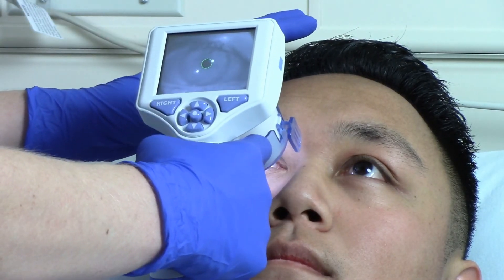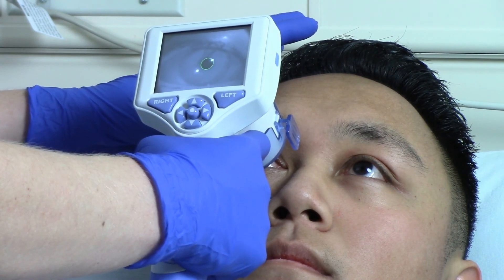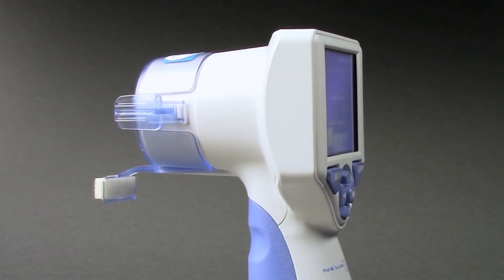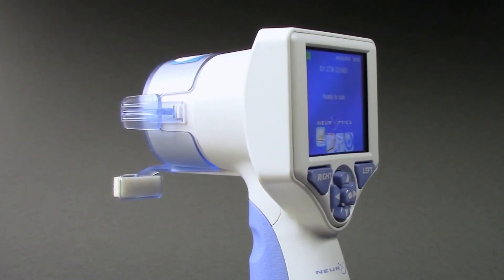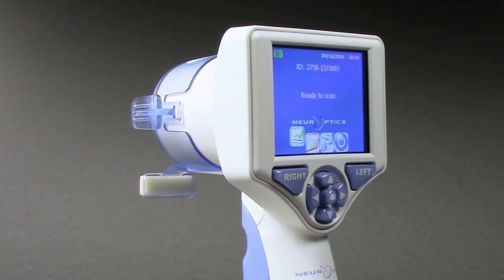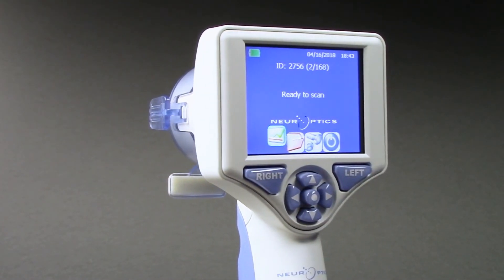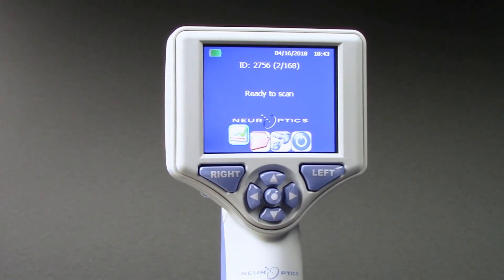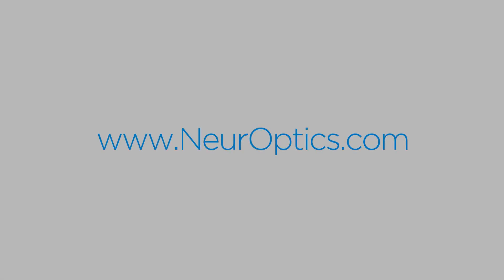Automated Pupilometry provides accurate, reliable, and objective pupil measurement independent of the examiner. By removing subjectivity from pupillary evaluation, the NPI 200 Pupilometer provides benefits to clinicians and patients through its ability to detect subtle pupil changes and to trend these changes over time, improving patient care. For more information about the NPI 200 Pupilometer system, including instructions for use, cleaning instructions, and clinical publications pertaining to pupillometry, please visit Neuroptics.com. To contact your local representative, email info@neuroptics.com.